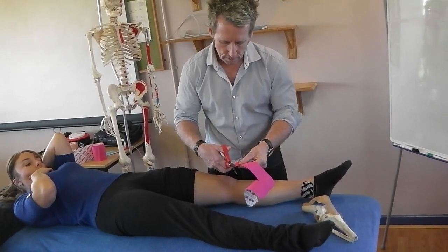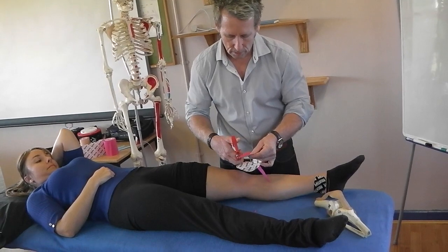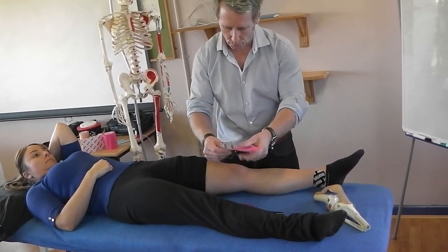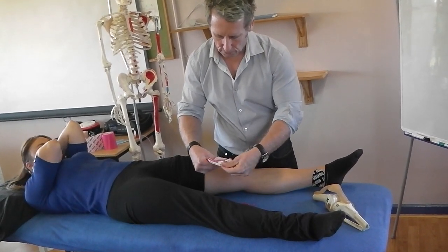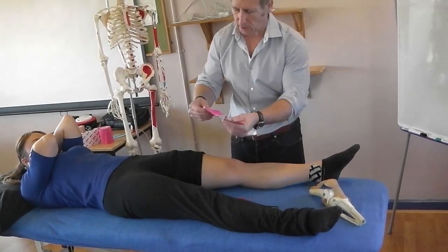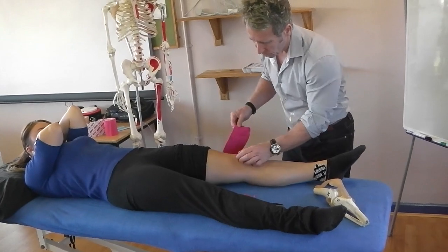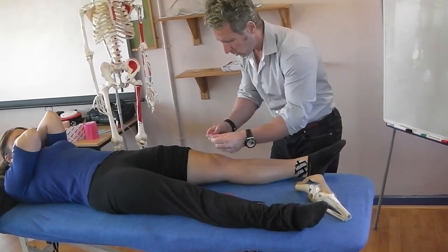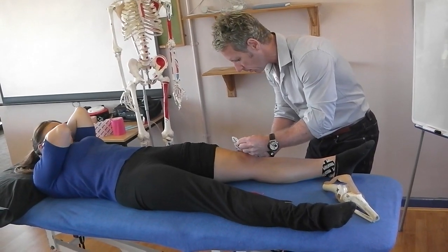Round off this end and corner as well. So now we've got a 10 centimeter tape that's prepared. We're going to split the tape on one end and just leave that bit on that side. I'm going to apply that lateral to the knee. This is where the patella sits — you've got the inferior pole and the superior, the apex and the base. I'm going to make sure I cover the whole of the knee, so this is going to go lateral here.